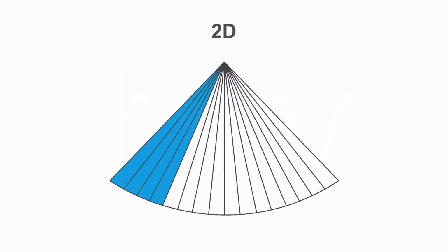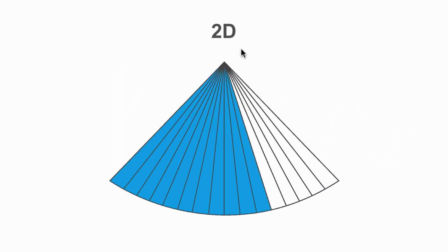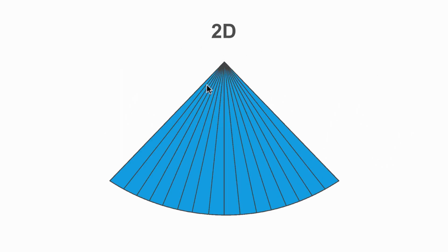Now this is a 2D image. The probe is up here. The ultrasound is being emitted. The machine is waiting for it to come back, and then it's sending the next beam down. So it does this, it sweeps across the sector like this.